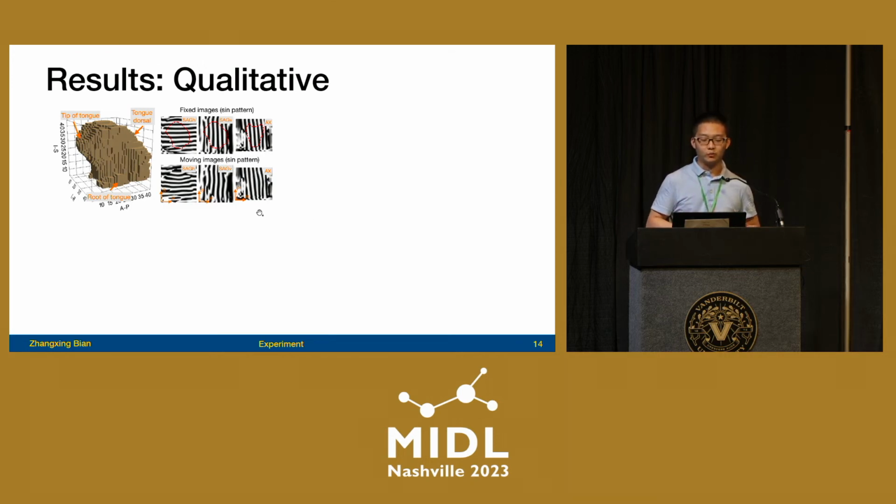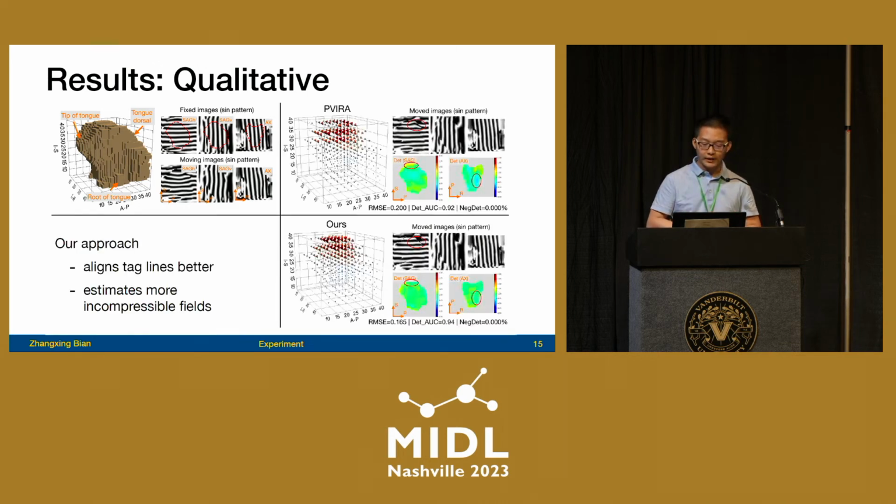The moving image is when the subject speaks "Xing", so the tongue will move backward and downward.